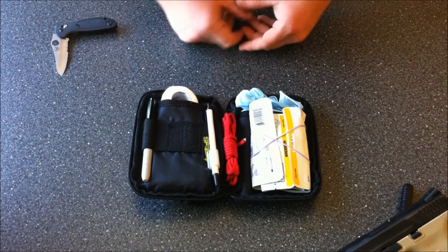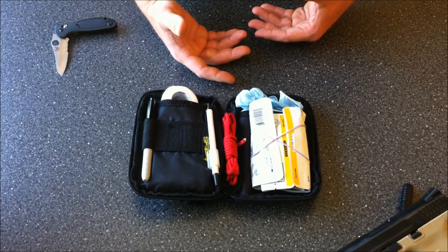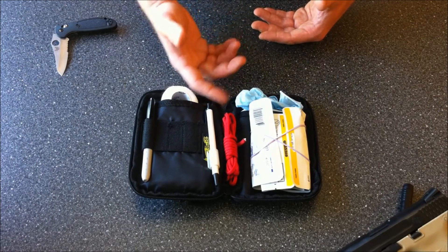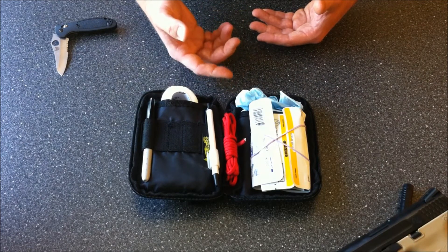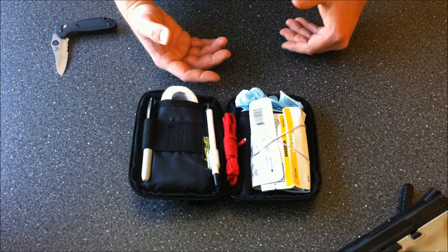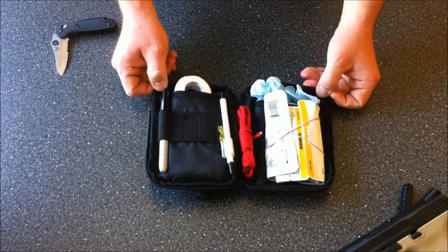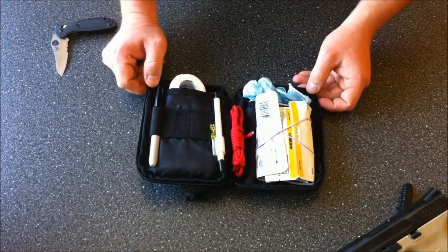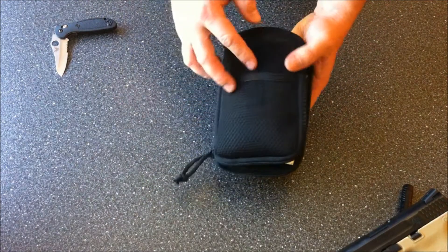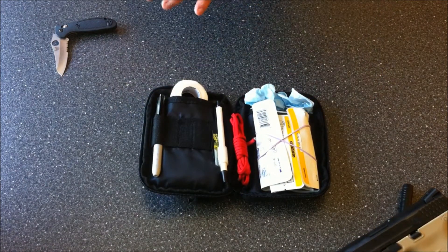You've got a kit with you because in a situation like that, 911 response isn't going to be able to get to you right away — that scene has to be declared safe. If you're out in the woods and you've called 911, who knows how long it's going to take for that ambulance to come out. Having something like this is definitely worth the investment. I chose this style case because it's lightweight and small enough that I can wear my belt comfortably.